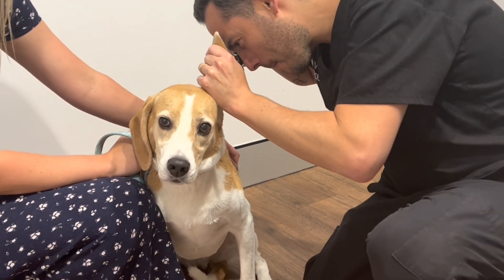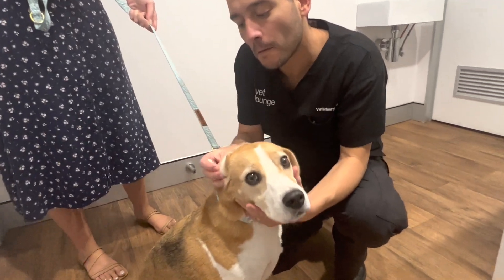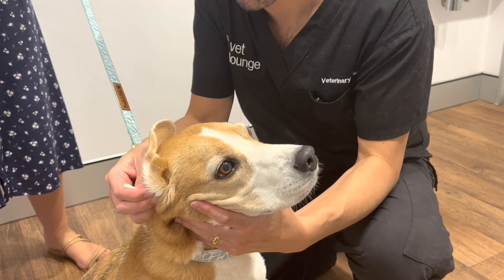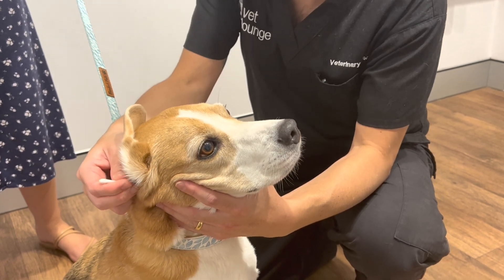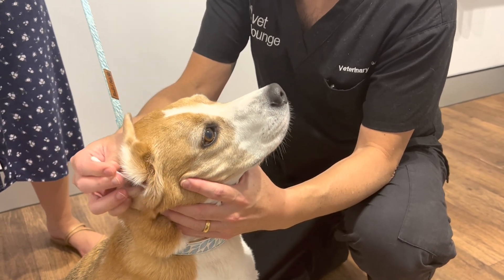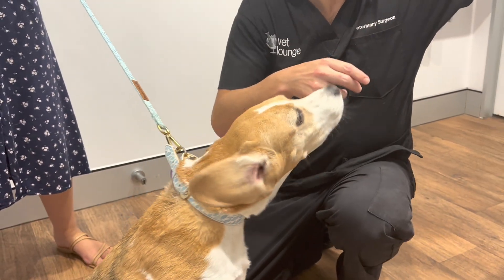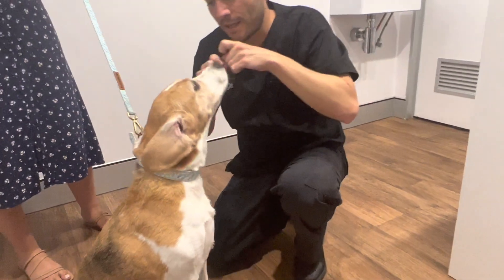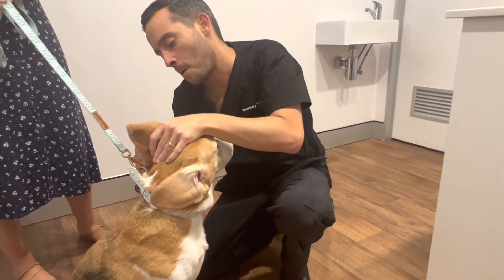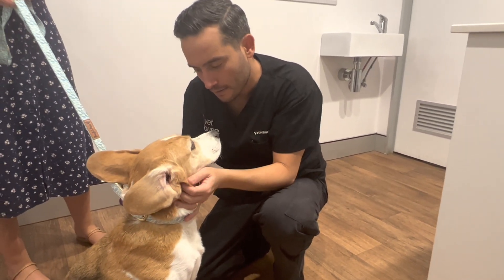To collect the sample for testing, we insert a cotton bud swab into the ear and extract some of the discharge. We do not recommend the use of cotton buds at home — they are only used in these circumstances to collect samples. Each ear is sampled with a separate swab to determine if infections are in one ear or both.